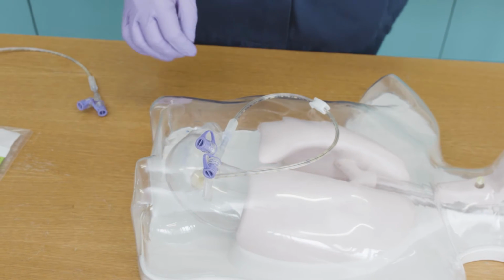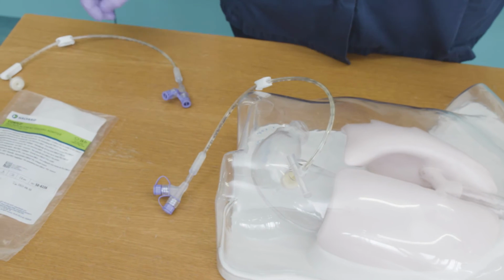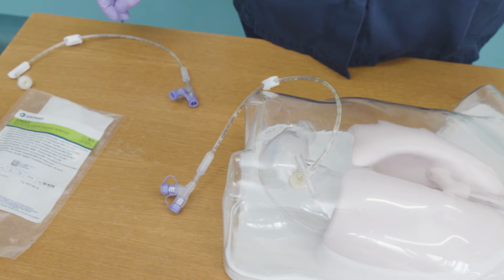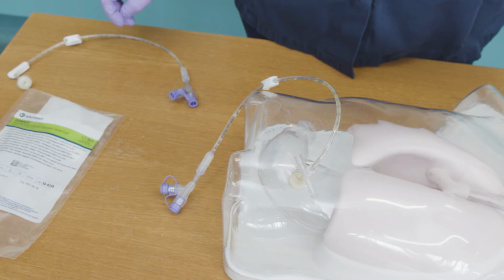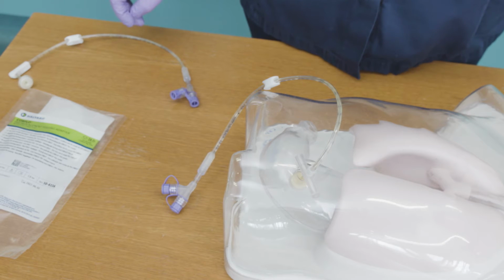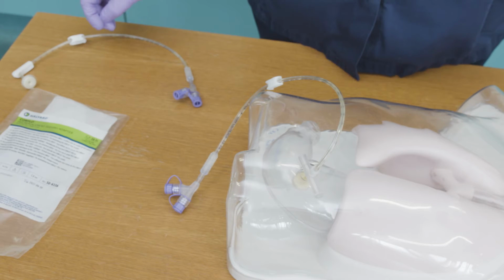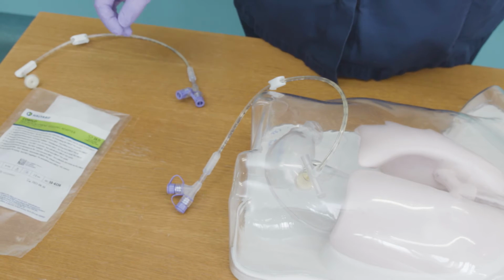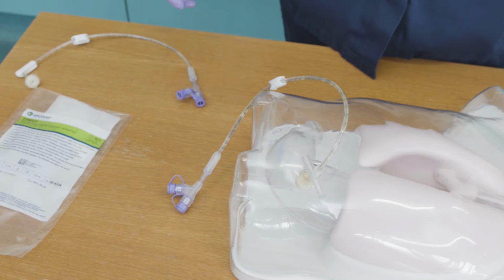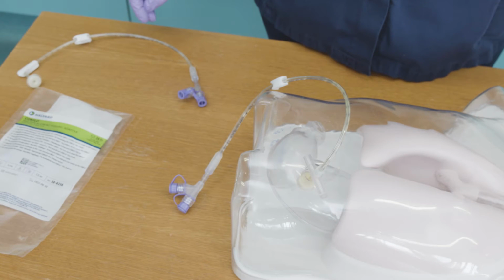This video will also explain how to advance and rotate a Corflo feeding tube. Once the PEG tube has been in place for 2 weeks, it must be advanced and rotated at least weekly and no more than daily in order to prevent the bumper inside the stomach from becoming stuck and buried in the stomach lining. Firstly, wash your hands for 20 seconds, wear gloves and apron if in a clinical setting, and get consent from the patient.